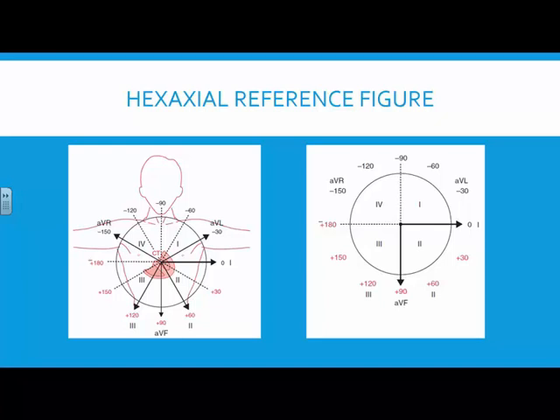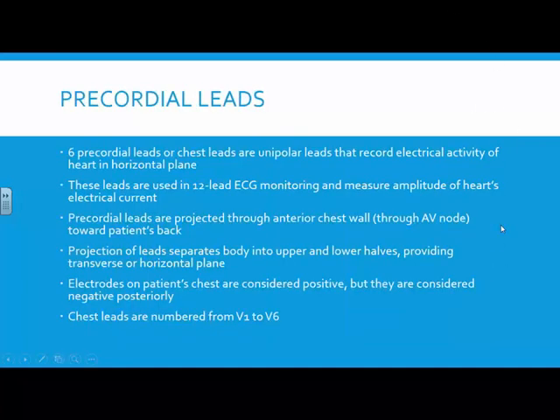All of these leads, although they give us a different angle of the electrical conduction system in the heart, we don't really have to use them continuously. Does that make sense? But when we get into 12 leads, you're going to be glad that we understood the AVRs and all that. AVL, AVF, and leads 1, 2, 3. Okay? Don't even worry about those. Okay?